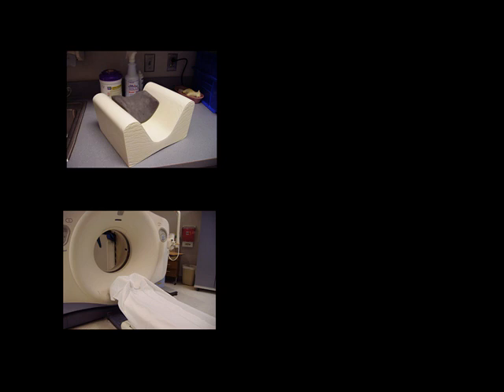Now I have a little short video on how to position the patient for a head CT. I'd like to say thank you for Alicia. Some of you may recognize her for being my patient.